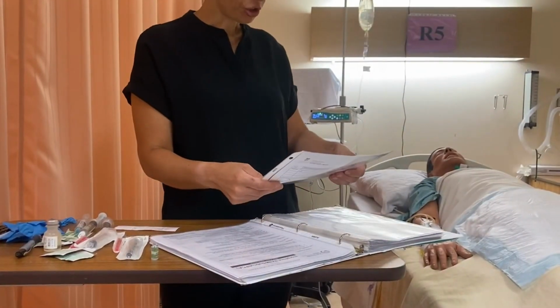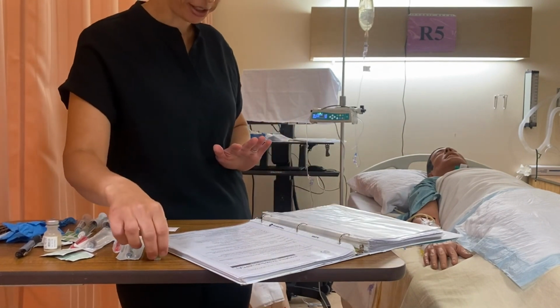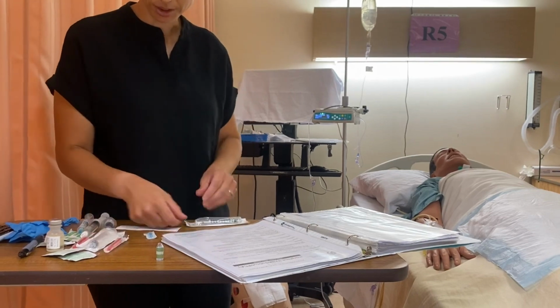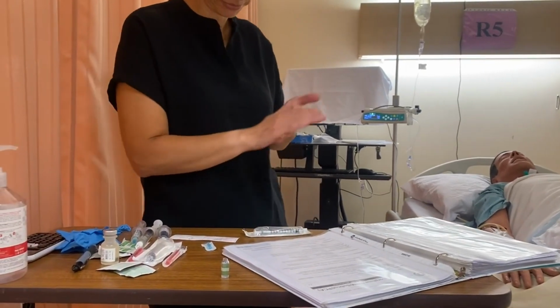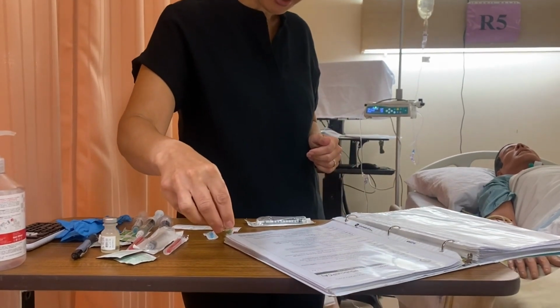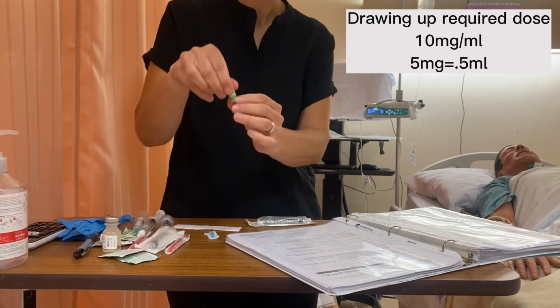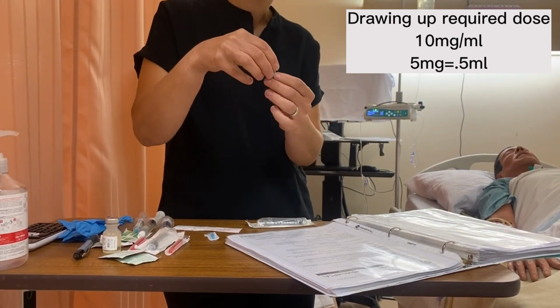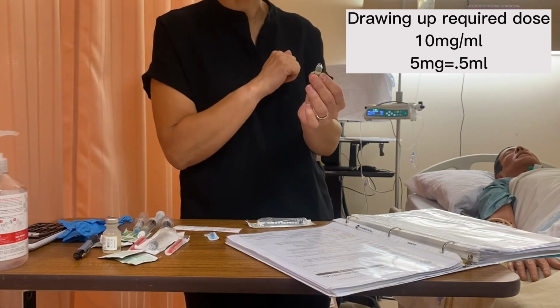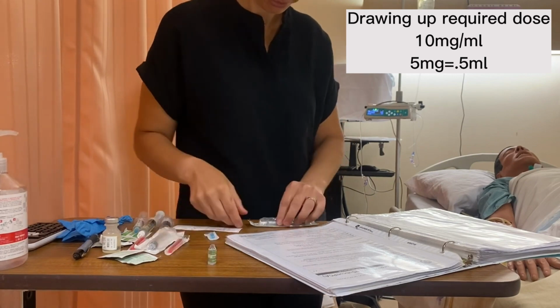So I've done my first check. I've checked my order. I've checked against my vial. So I'm going to draw up the medication that I require. I'll do my hand hygiene. Okay. And doing my calculation, I know I need 5 milligrams. The concentration is 10 milligrams per mL, and I know that because it's on my vial. There are other concentrations of morphine, so make sure you pay special attention to the concentration. So I know I need 0.5 mLs.